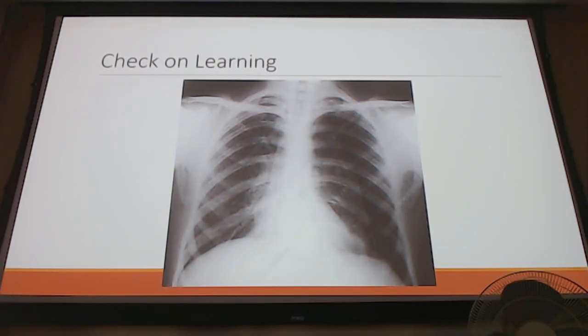And we touch on there how to measure and all that. We really just look at it like, is it small or not small, or is it huge? Is there no lung in there? So this is kind of in between, right? This is like not small. Do you guys think there's a mediastinal shift on there? Yeah, it looks like it's shifting a little bit, right?